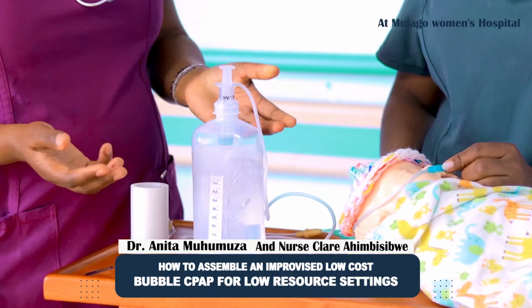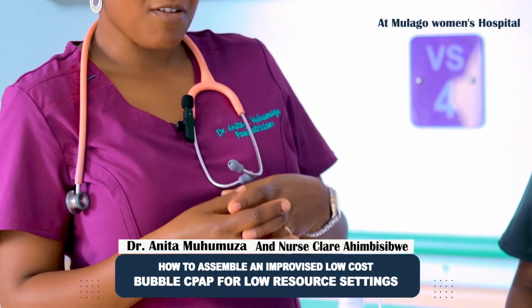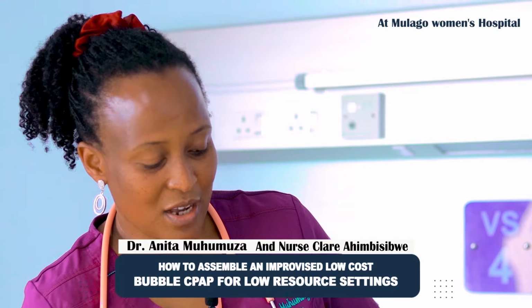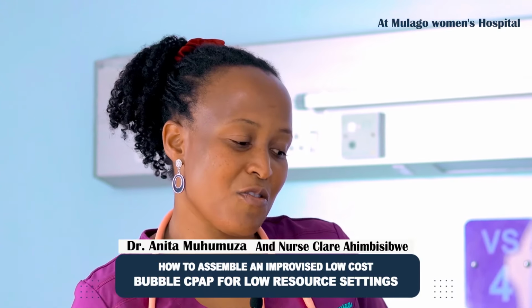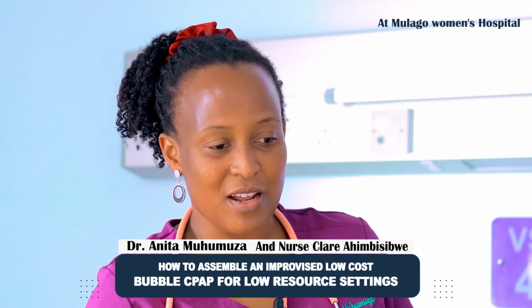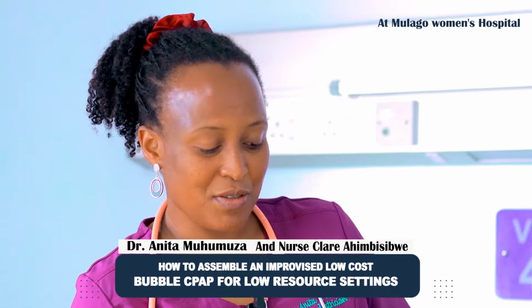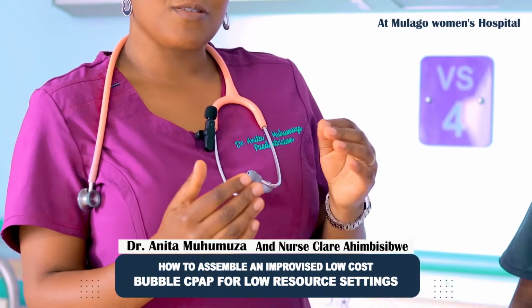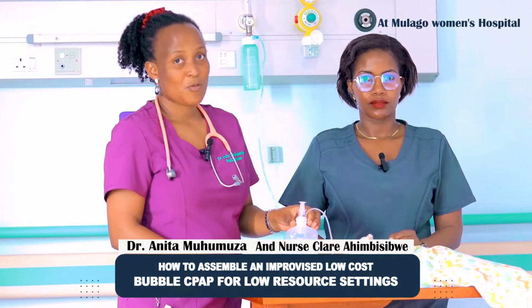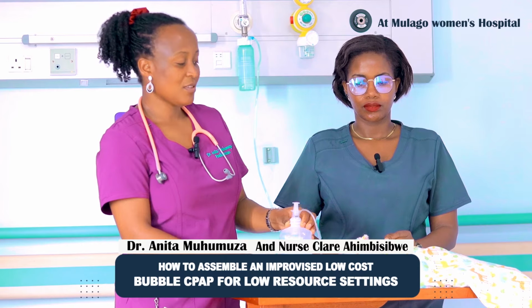So this helps to keep a positive pressure in the alveoli, so that even as the baby breathes in and out, the alveoli remain wide open for gas exchange to happen. And this helps babies who have respiratory distress so that they do not keep on using a lot of effort to breathe in and out, because they can tire out and get respiratory failure. So our bubble CPAP helps the baby reduce the effort they have to use to get in another breath on every cycle. So we have set a PEEP of 5 centimeters of water, as you can see. This is the pressure we need.